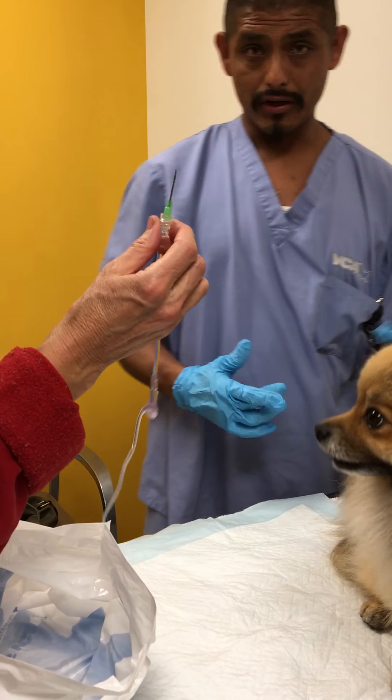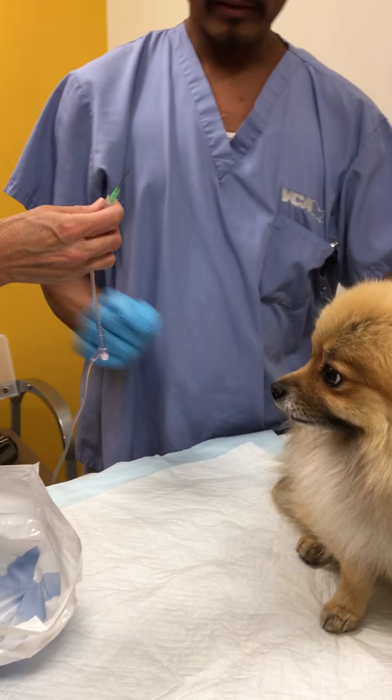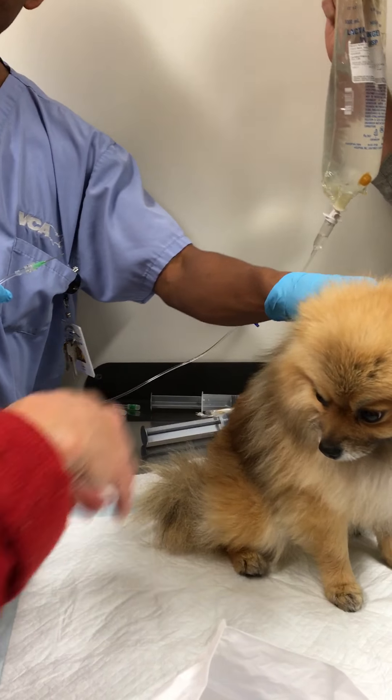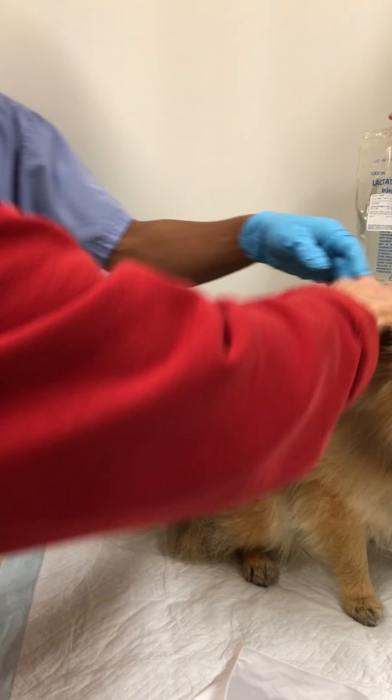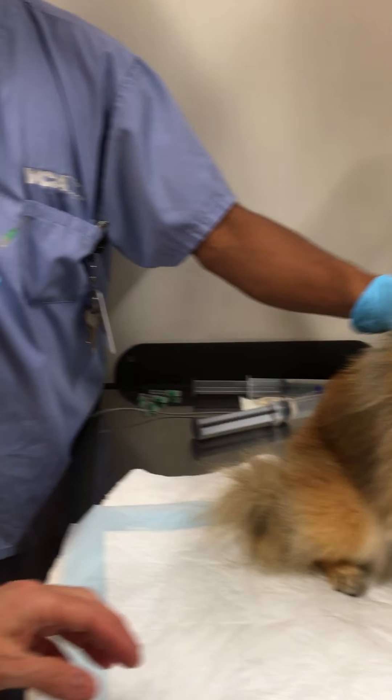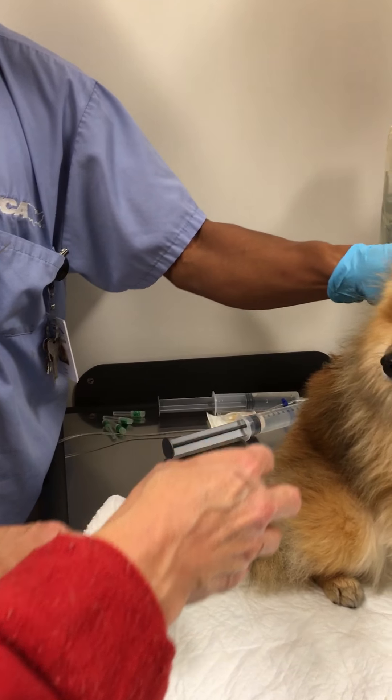Next thing we're going to do is the fun part. Usually the less painful spot is between the shoulder blades. We're going to get the tent. Yes. There we go. I know about the tent. I feel the tent. There's the tent. We're going camping now. You just want to go right between the shoulder blades, okay?